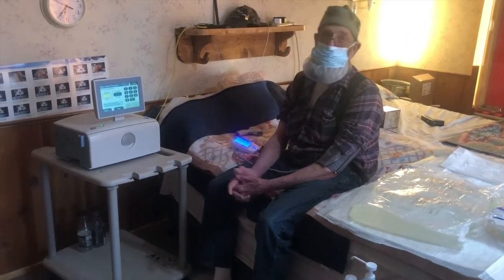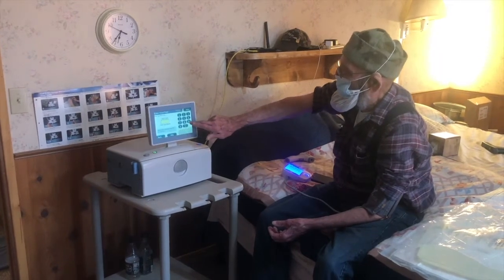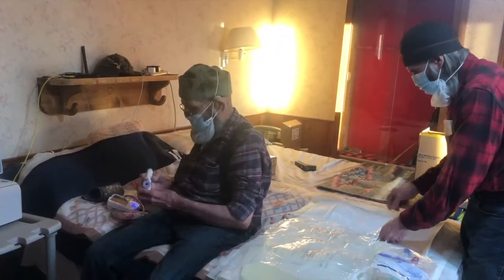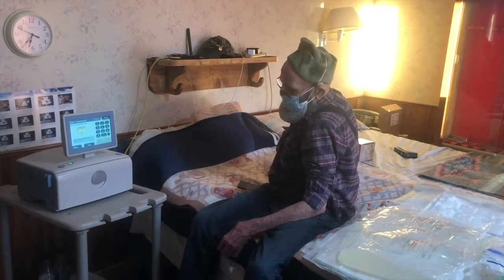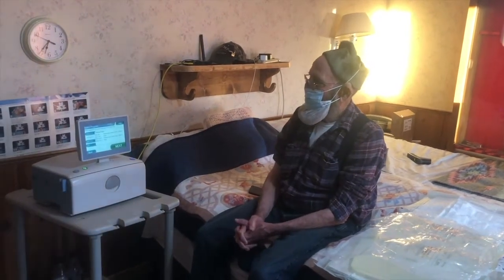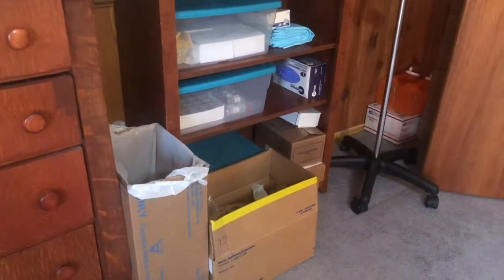135 over 96. And 98. Enter your temperature. 98.2. That's good. Select a program, then touch next. And our program is always the yellow. It's 1.5. So we always use the box that has the yellow tape on it. That yellow tape denotes that that's a 1.5 box. And that's what we use.